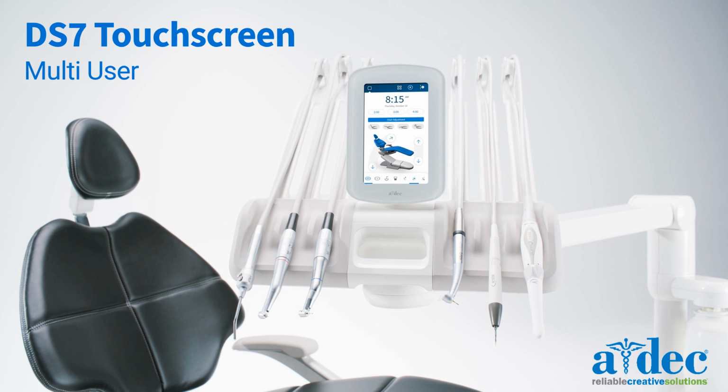In this video, we will discuss multi-user on the DS7 touchscreen. Note, offline multi-user functionality is available on the DS7. However, syncing user accounts across multiple devices is only available on delivery units that have been registered to an A-dec Plus account. User accounts can be added or removed by the clinic administrator.